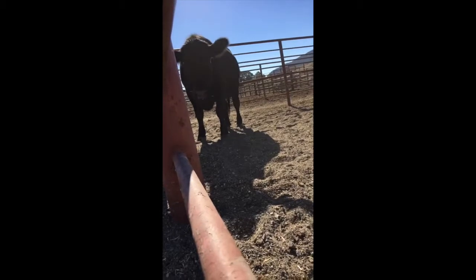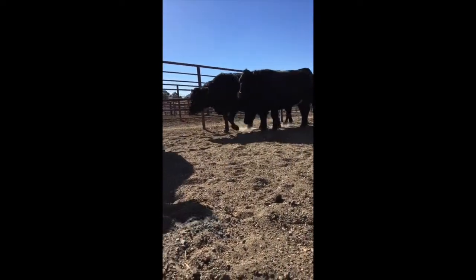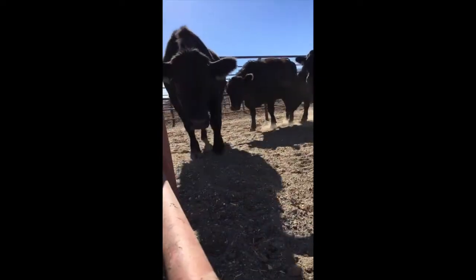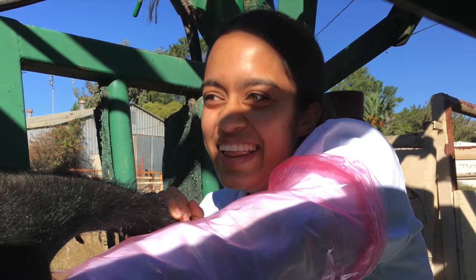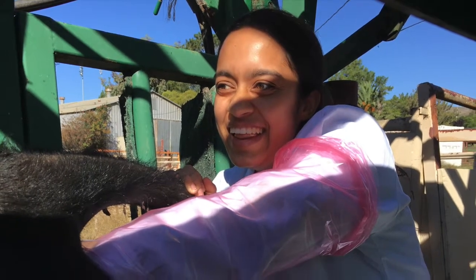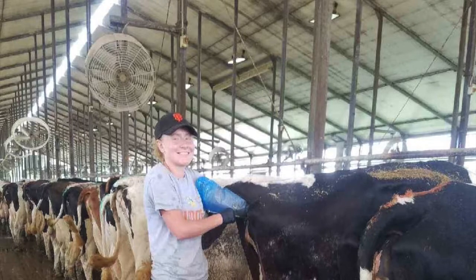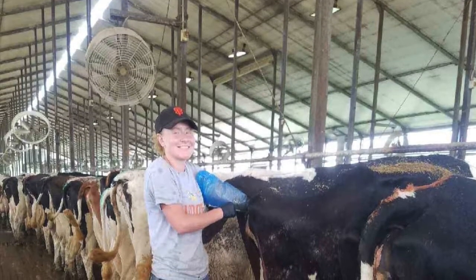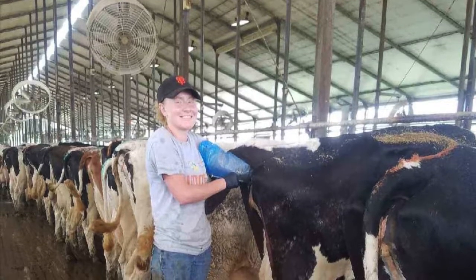In the artificial insemination lab, we learned how to prep for artificial insemination and perform the task on a heifer. Prepping was quick and easy once you knew what to do. Once you got to your heifer, you had to palpate her per rectum to find her cervix and grab onto it. Then you wiped the vulva with 4 different cloths and put the breeding rod through and into the vagina.